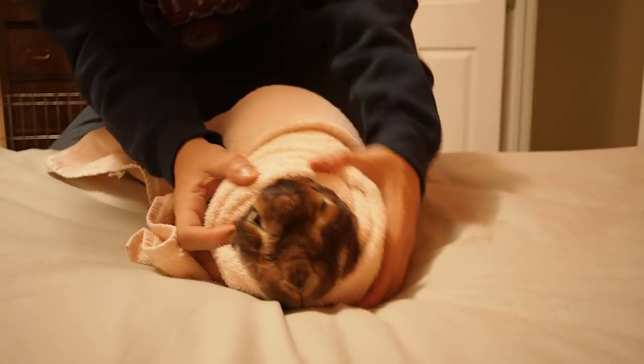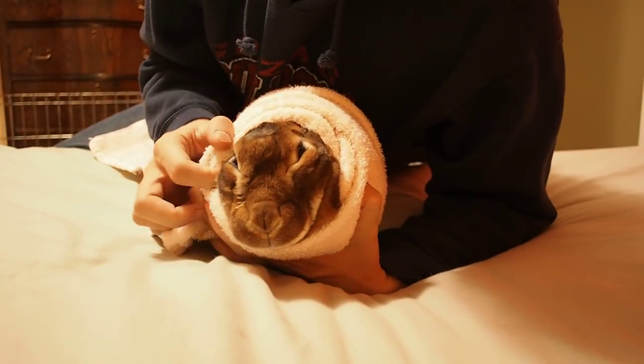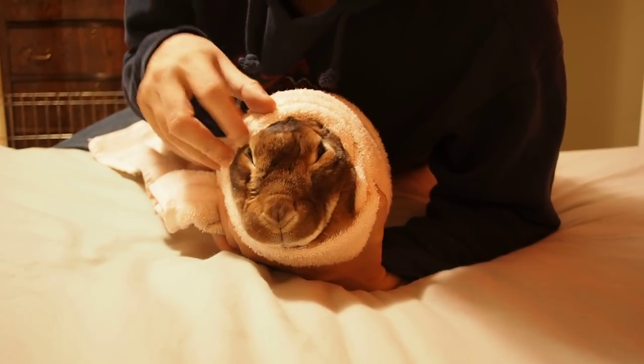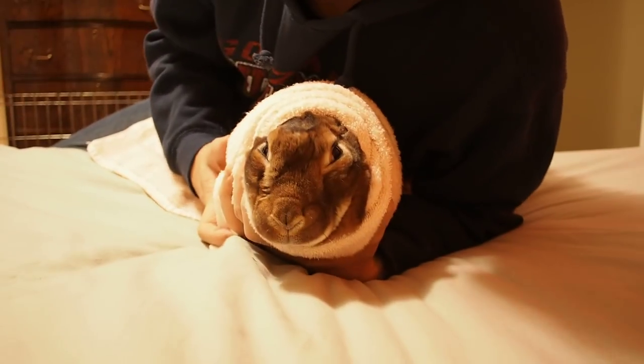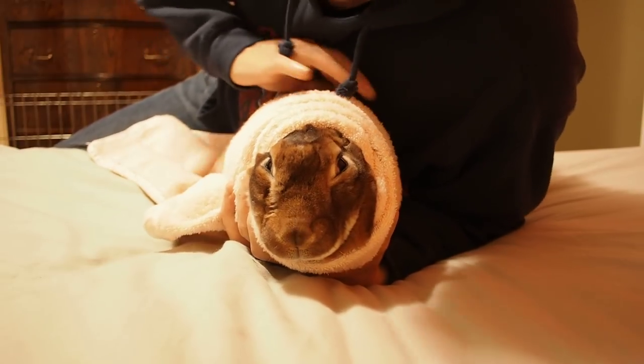Now they can still get out of this, so you want to make sure to hold like that, on both sides. I'm putting a little pressure on both sides here and I'm pulling down. She can still get out of this, so I have to make sure to hold her like this, and also put a little pressure right on the bottom — usually to the left, not right on the spine.